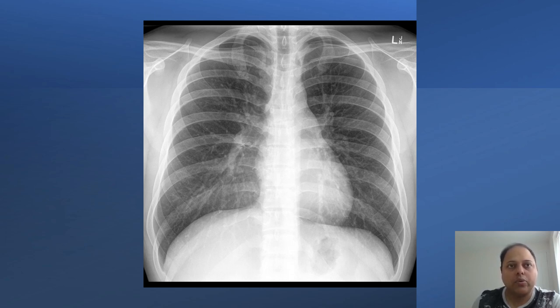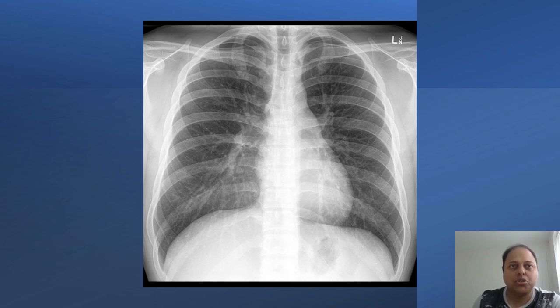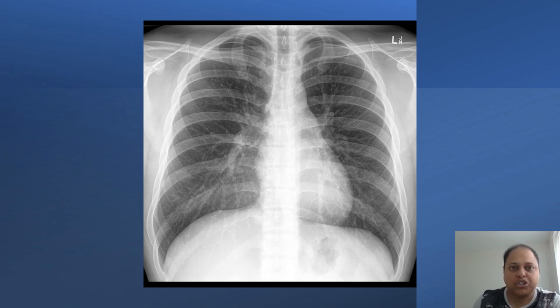Every chest X-ray tells you a story and your job is to read it. Just as a story has a main protagonist, in a chest X-ray you should first look for the patient's name, and the date and time of the X-ray. This will also show the projection of the chest X-ray — AP or PA film — and sometimes there will be a marker indicating the left and right side of the patient. The next thing to note is the rotation of the X-ray.